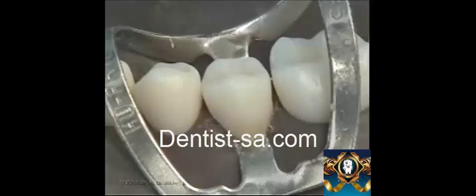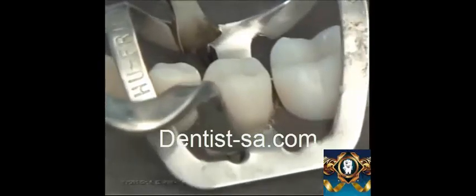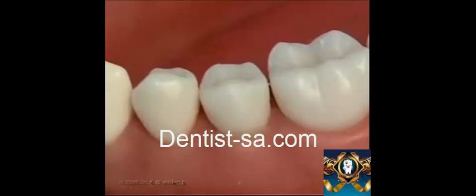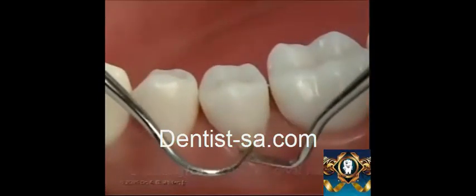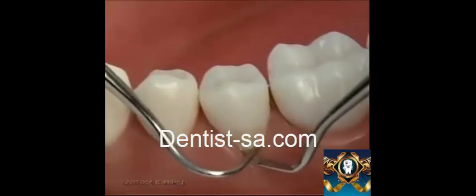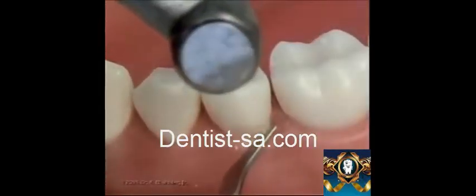Now the cervical retainer can be removed to evaluate the gingival extension of the restoration, or any gingival overhang or any voids or deficiency in the filling. An explorer is used for this. A rubber cup or rubber point could be used to remove this excess. The rubber cup is being used here. The blunt-end instrument is used to slightly retract the gingiva.